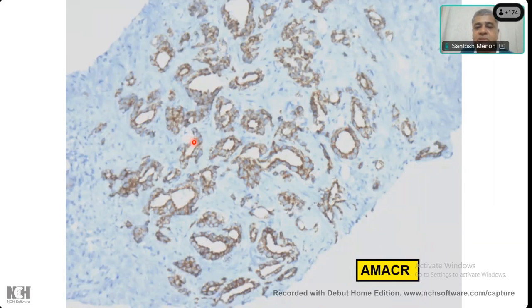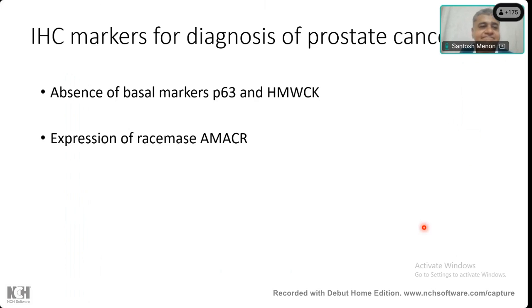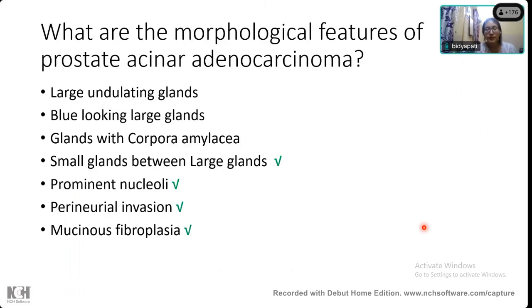All the glands should be circumferentially stained, and it should be a granular staining, which is called a true positivity for AMACR. And that's why it has some technical issues. And many a times AMACR can also be positive in benign glands and atrophic patterns, partial atrophy, post-atrophic hyperplasia. All those can be AMACR positive. So it is important not to do only AMACR staining. Understood? And agreed? Yes. Okay.